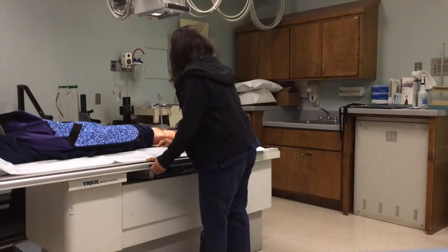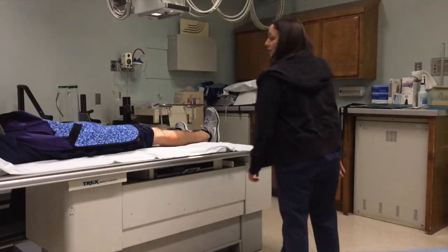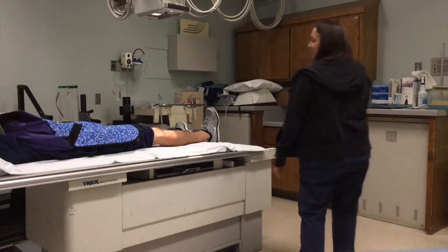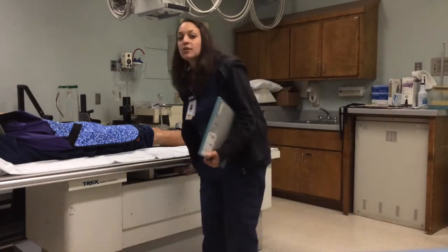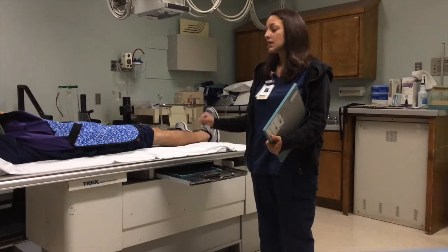There we go. My right marker is on the right side. It's out of the view. I'm going to keep my technique at 70 to 4. So it'll be just a minute. Hang on. Beep. Okay.